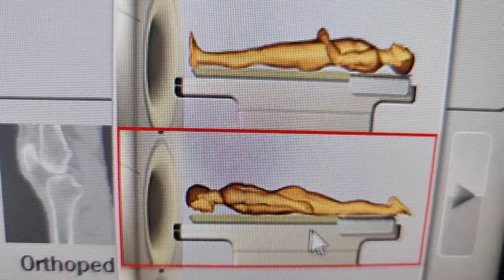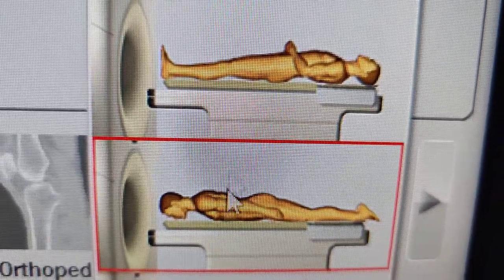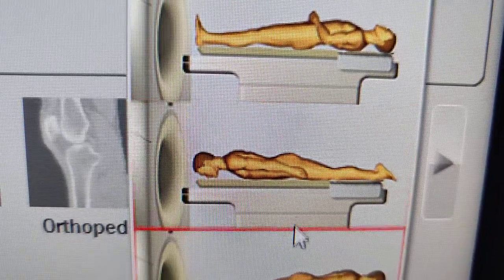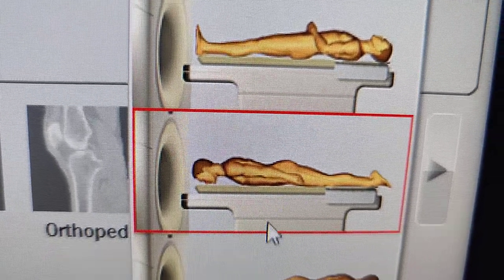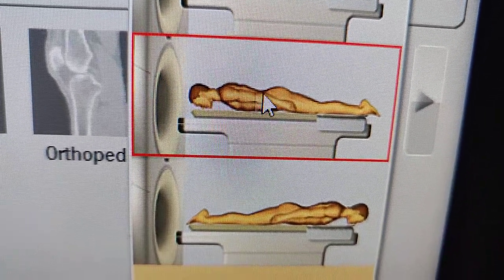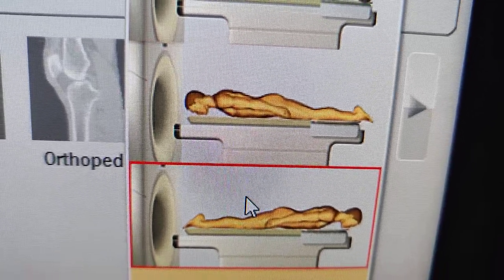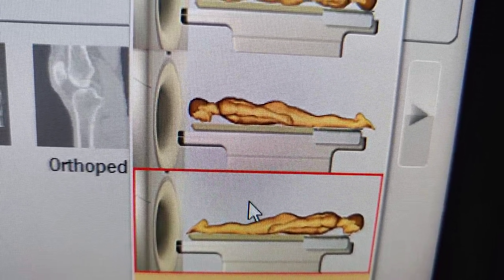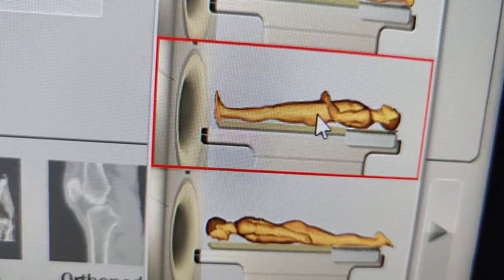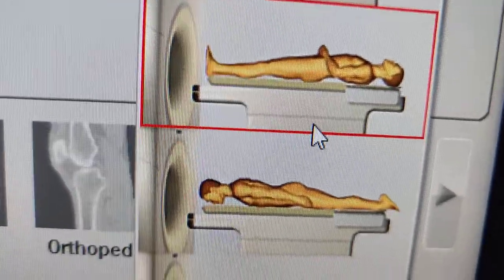You can always switch the anatomical positions on the scanner itself, so it doesn't matter which way they're laying. As long as you select the correct position, you can lay the patient that way. But ideally, it is supine — ideally — but it's not necessary.